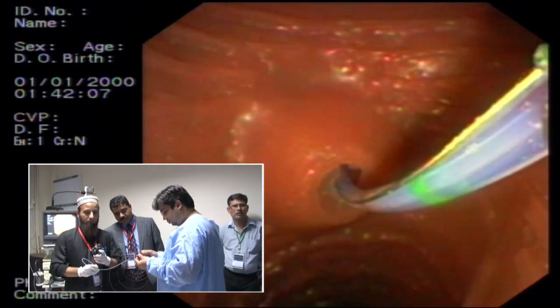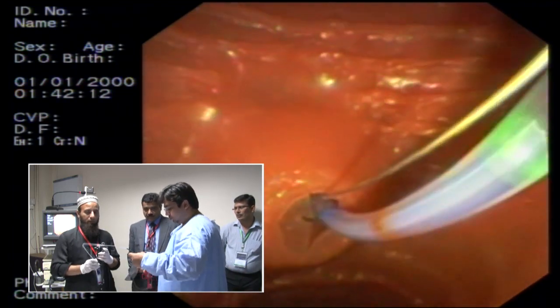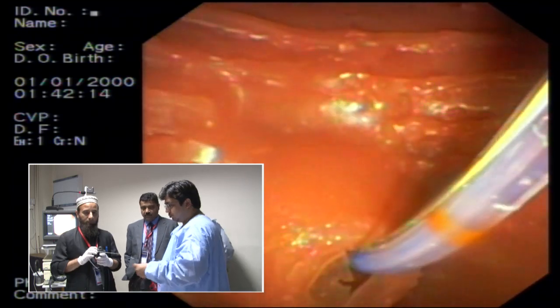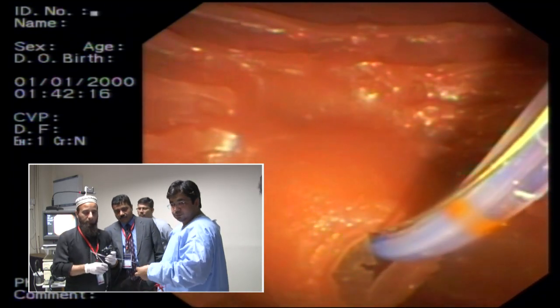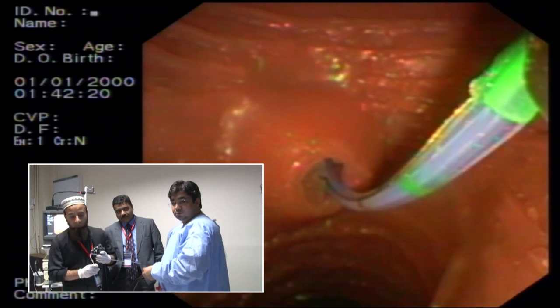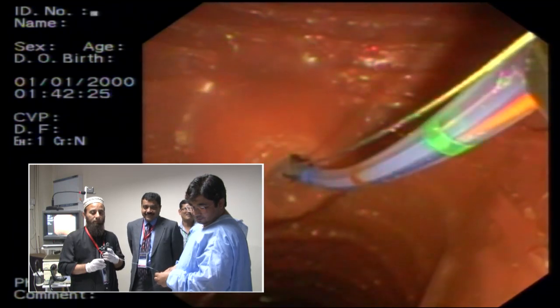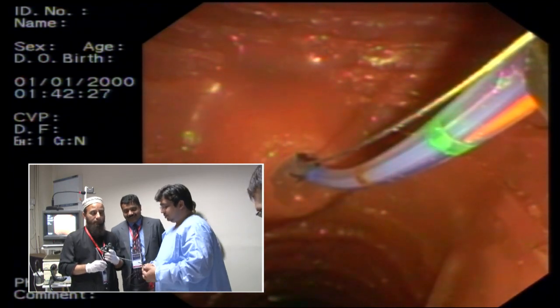ये वो कर रहे हैं कम्युनिकेशन, वायर एक्सचेंज एंड दैट्स इट। अभी मैं इनको असिस्ट कर रहा था, आई वाज डूइंग इट वेरी बैडली। You don't want a doctor to assist. I had to use my mouth to hold the wire. जो मुझे कह रहा था, I was doing it.